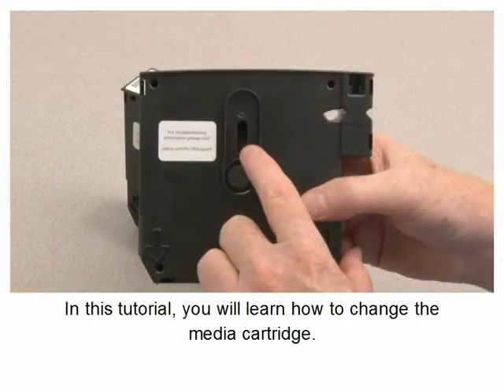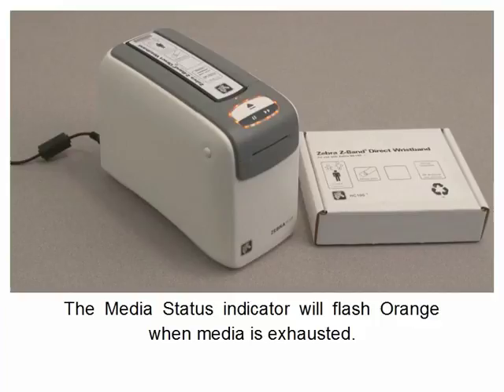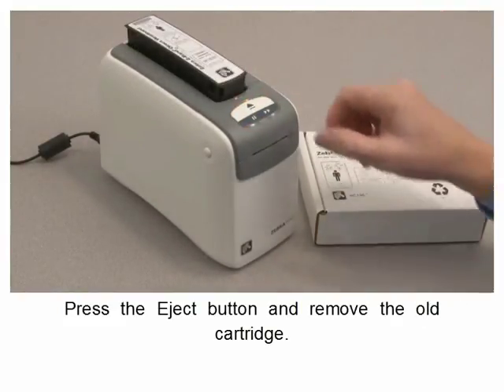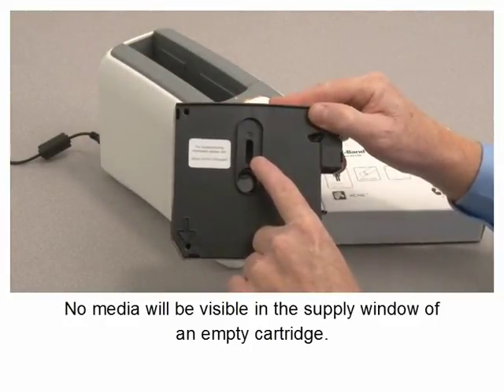In this tutorial you will learn how to change the media cartridge. The media status indicator will flash orange when media is exhausted. Press the eject button to eject the cartridge. No media will be visible in the supply window of an empty cartridge.